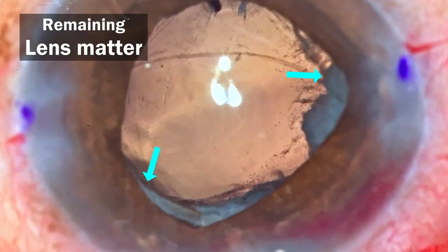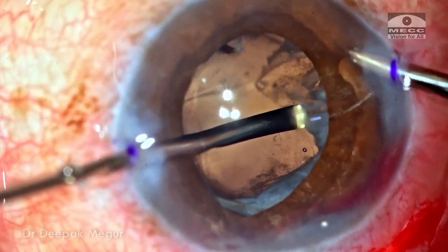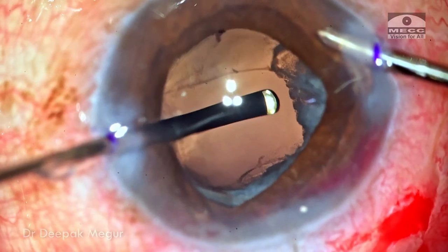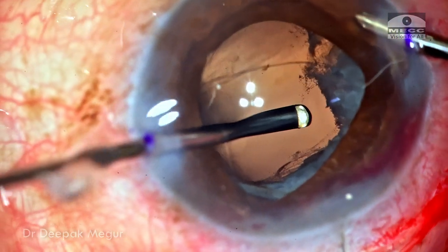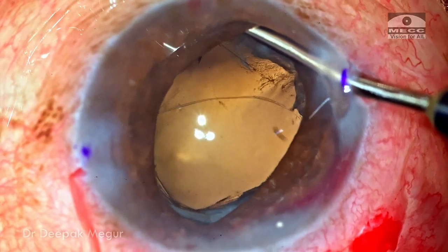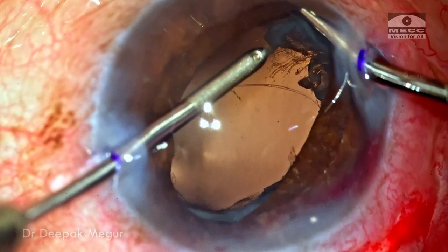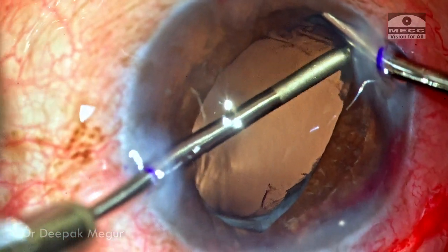We can also see areas of remaining lens matter which need to be dealt with. The vitrectomy is continued by swapping hands, and once the vitreous prolapsed in the anterior chamber and around the posterior capsule is cleared, it is time to deal with the cortex. I've gone in with bimanual irrigation aspiration — only after confirming there is no vitreous around. I retract the iris with the irrigating cannula to visualize the quadrants where cortex is present and then aspirate it.